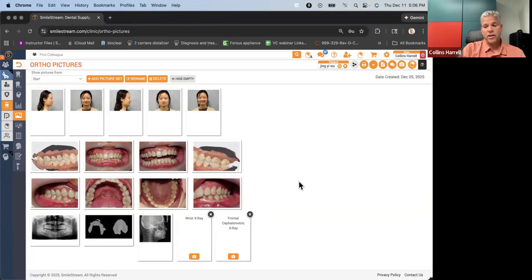And that's why I would then work on some occlusal equilibration to get a stable posterior occlusion and fix the rest of your overjet problem with some upper IPR. Because I agree, if this is the patient's actual bite, I don't think you're going to probably correct quite that much class 2, but you're not going to extract this patient.